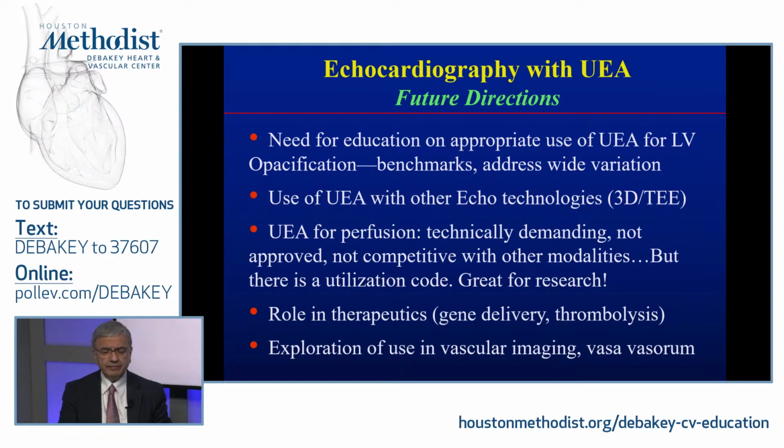Perfusion is a different situation. I really think, we've done a lot of work in this field also in the past, and there are pioneers in this country and in the world that have looked at ultrasound enhancing agents. It is technically more demanding, and up to now it is not approved for clinical use. In my view, it is less competitive compared to other modalities. Nowadays we have PET on board, we have CMR with perfusion, and we have the regular SPECT. So it is much more demanding, and there is some more variability in the interpretation, particularly in the cardiac base, and at times that's important.